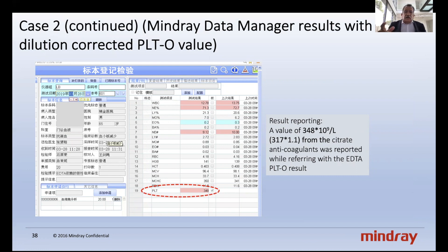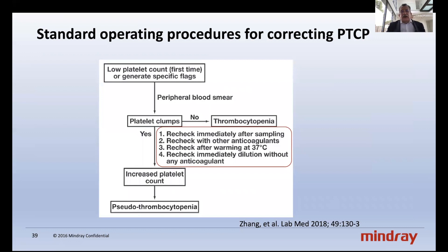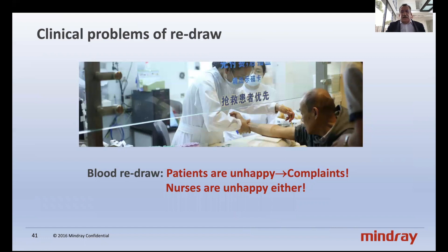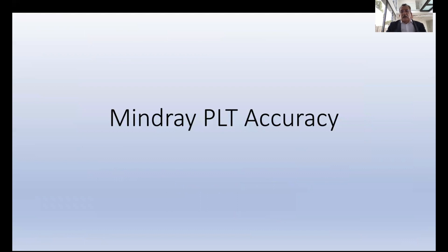If you use citrate, you need to apply a correction factor — in this case 1.1 — to account for the sample dilution with citrate. Regarding time cost, the schematic published by Zhang shows that rechecking with other anticoagulants and warming takes 45 minutes per pseudothrombocytopenia case. With the Mindray optical method, the time lost is only one minute. This also means patients won't require a redraw, making both patients and nurses happier.